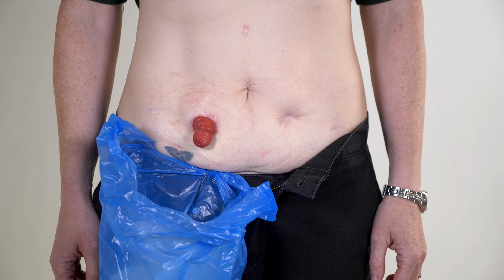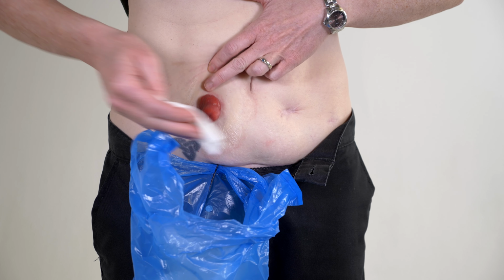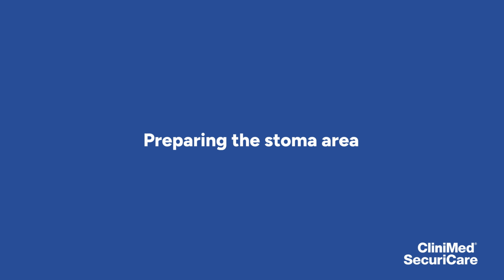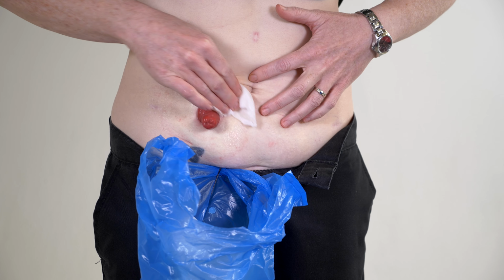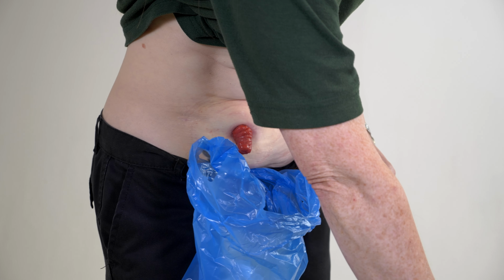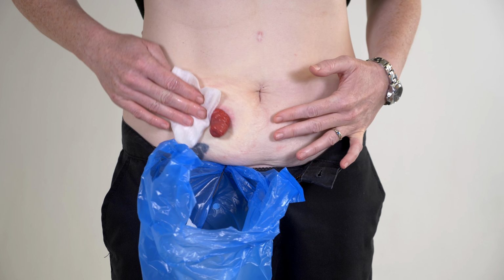Use a dry non-woven wipe or a clean washable cloth to remove any waste from around your stoma. You can use kitchen roll for this. These can be placed in the same disposable bag as your pouch. Next, wash your stoma and the surrounding skin with warm water and a soft cloth or non-woven wipe. You don't need any soap, just water is enough. Then gently pat the area dry to make sure your skin is completely dry before applying a new pouch.